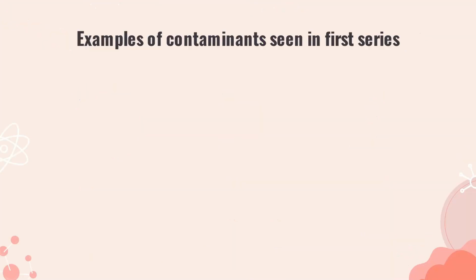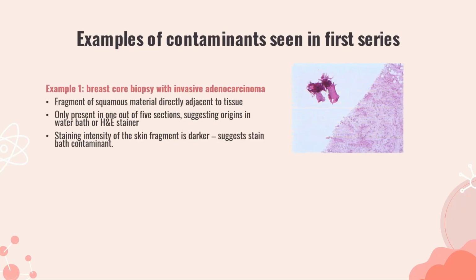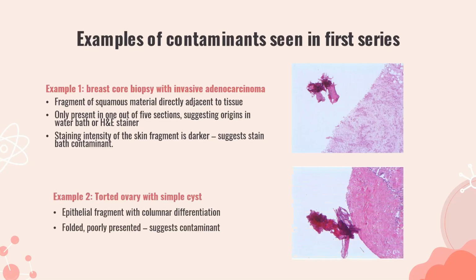Here are some examples of the contaminants observed before the changes were implemented. The first example shows a breast core biopsy with invasive adenocarcinoma, with a fragment of squamous material directly adjacent to the main tissue. This was only present in 1 out of 5 sections, which suggests its origin in the water bath or the stainer. The staining intensity in this contaminant was noticeably darker, and this suggests that the contaminant arose from the staining bath. The second example is from a torted ovary with a simple cyst, showing an epithelial fragment with columnar differentiation. This fragment appears folded and poorly presented, which are clues to suggest that it is a contaminant.